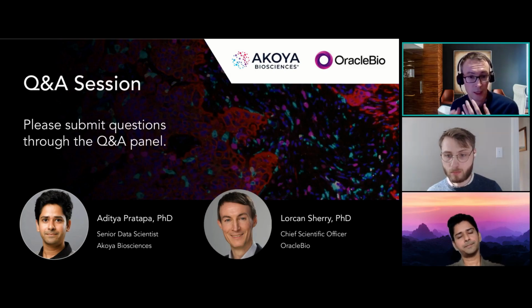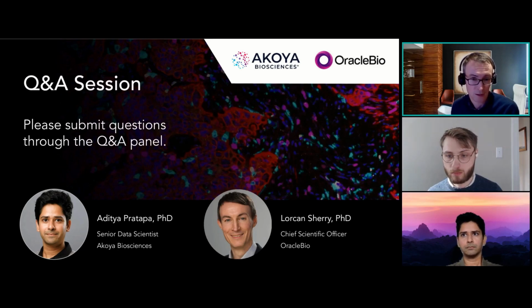We will go in for pathologist-assisted reads of those boxes to count the numbers of positive and negative cells for each of the marker channels. And then the algorithm will be applied directly to those boxes and the data generated. And here we would perform correlation analysis to compare the readouts of the algorithm directly with the readouts of the manual review. So yeah, certainly the algorithms can be validated in that format.